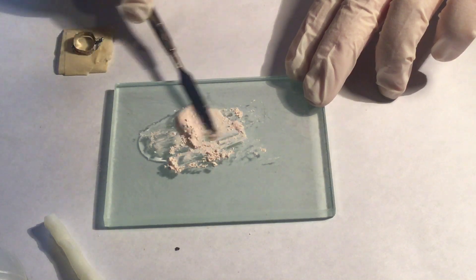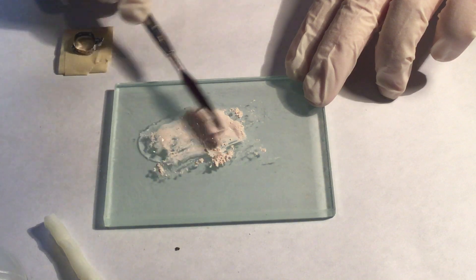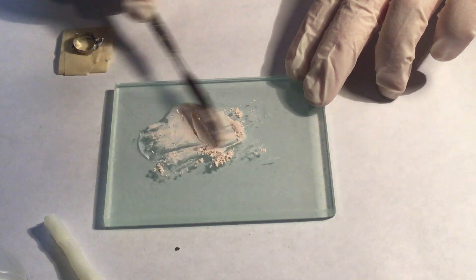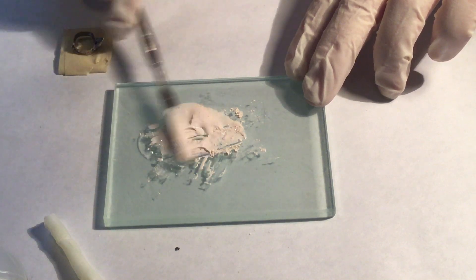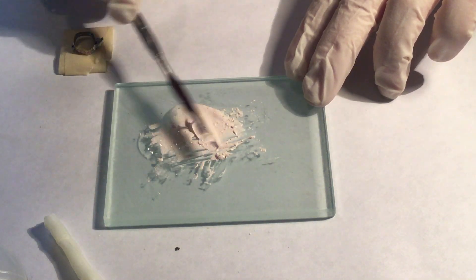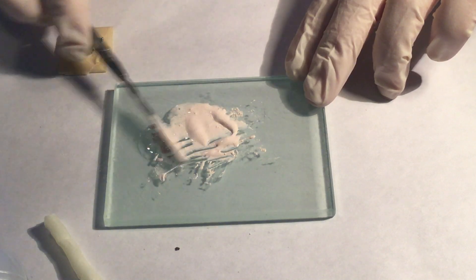Mix the cement for the recommended amount of time until you're able to string it an inch, ensuring that you're incorporating all of the powder. It's best to mix the cement in the middle of the glass slab.